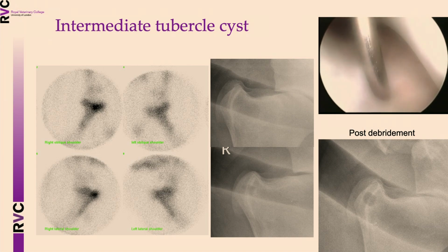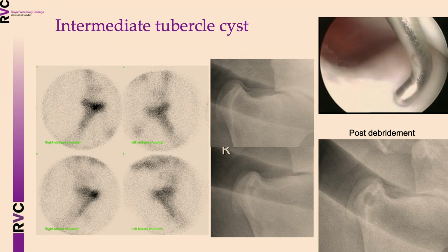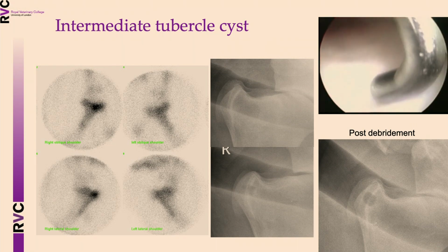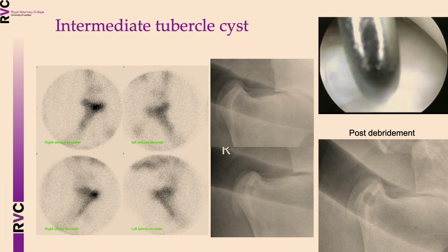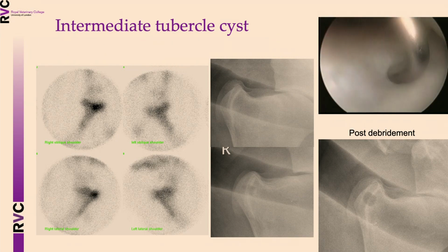You can hardly see the cyst radiographically, but it could be accessed bursoscopically, and this is after debridement.